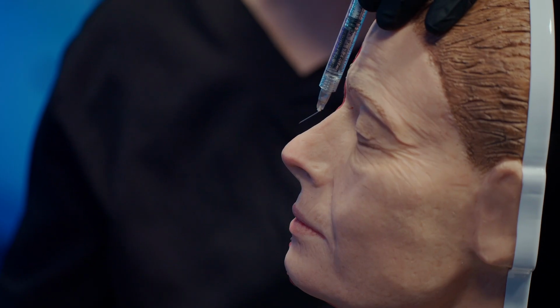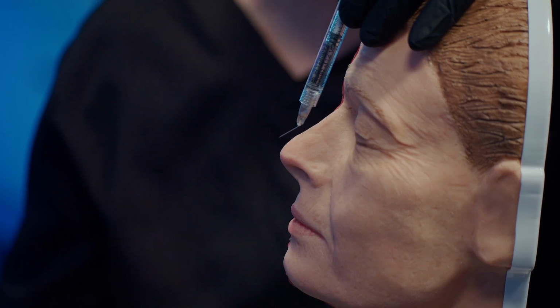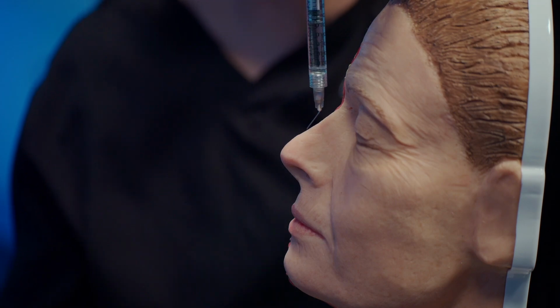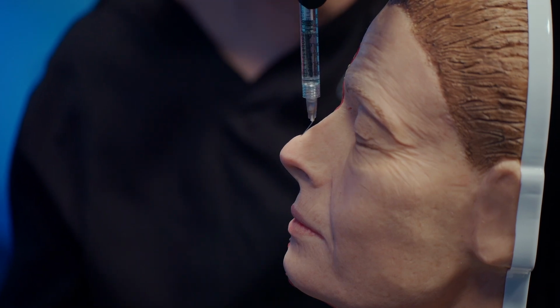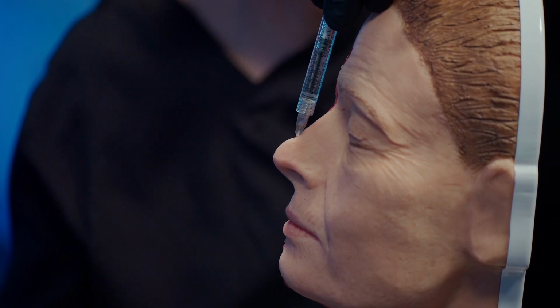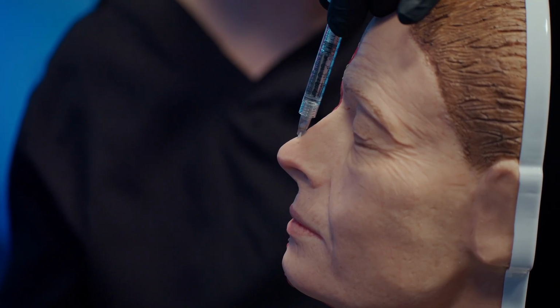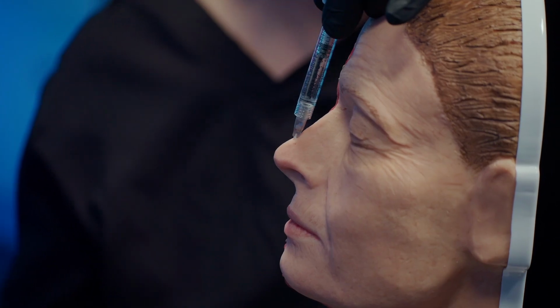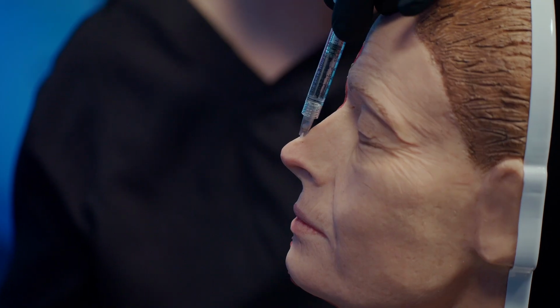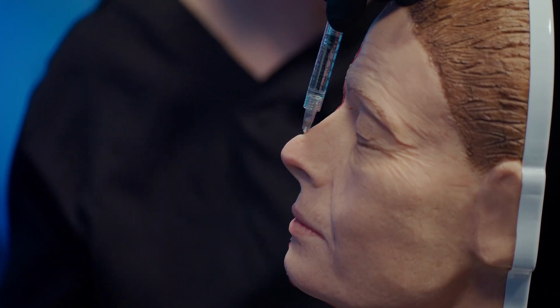So you can see how this bend enables me to stay at the right plane when I'm injecting. Now that I have this little kink, I can find my entry point, slide into the right depth, change angle so that I'm straight, then stay at the same depth as I slide all the way in. I can see the tip through the skin on the tip of the nose, which is a useful thing to know that you're doing. You're about to inject in the right place, and I can inject accordingly before sliding out.